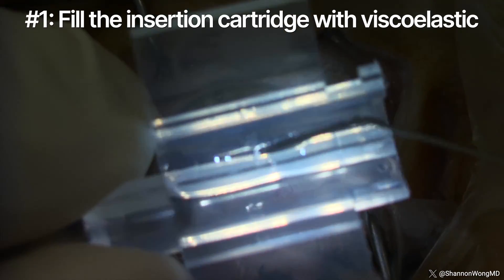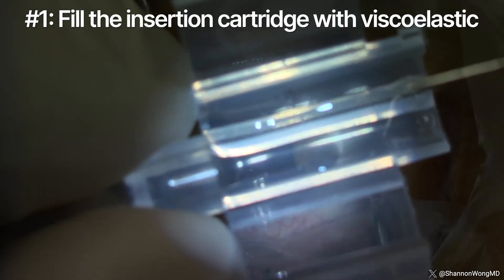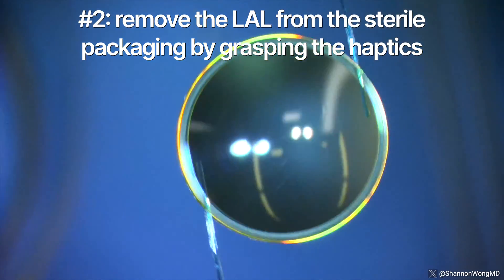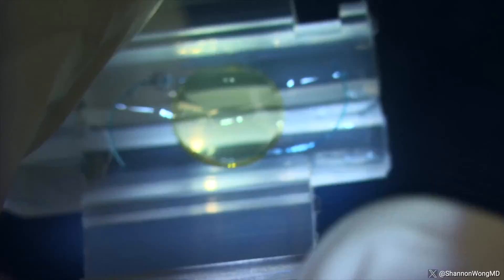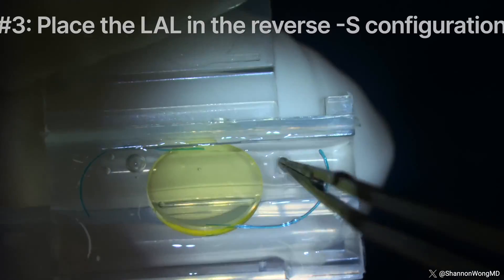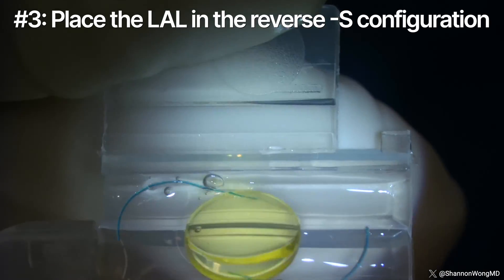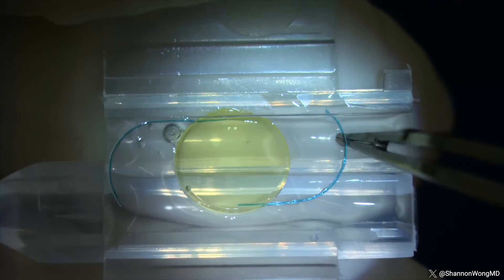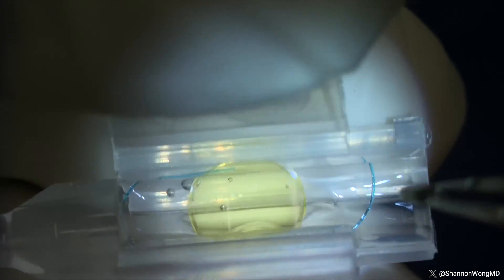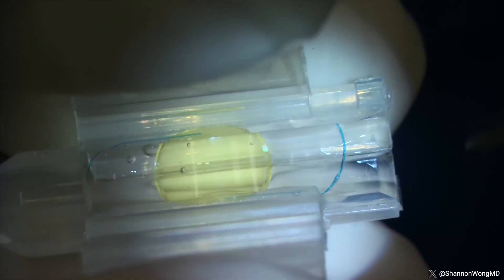Number one: we fill the insertion cartridge with viscoelastic. Number two: we remove the LAL from the sterile packaging and are instructed to hold the haptics with our instruments. We're advised not to hold the lens optic, as that may interfere with the active shield of the LAL. Number three: we place the LAL into the insertion cartridge in the reverse S configuration with the leading haptic close to the tunnel, then close the wings of the cartridge slowly to capture the edges of the optic.